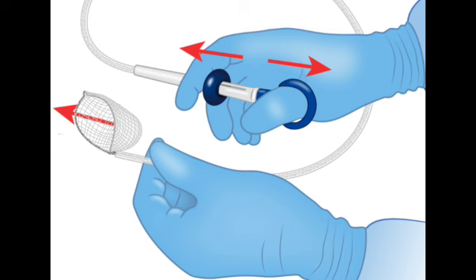Gives you very fine control. Right. So sliding it open pushes the net out into the colon. Sliding it closed pulls the net back into its little protective plastic sheath. A sheath. Why the sheath? That sheath is vital because the net itself, the mesh part, is made of wire. You don't want that wire scraping against the colon wall when you're inserting or retracting it.